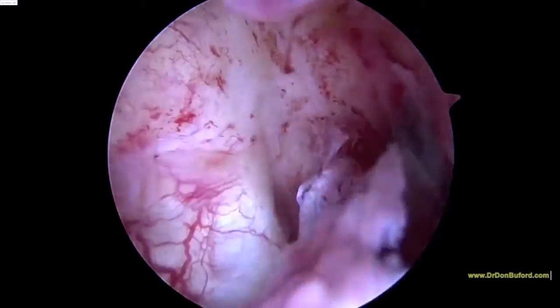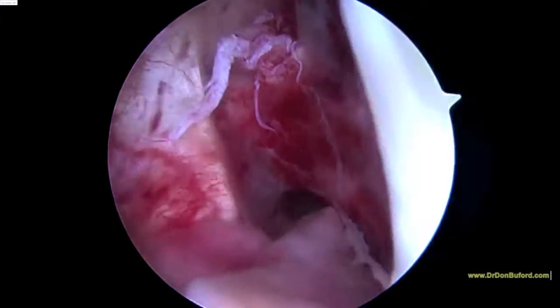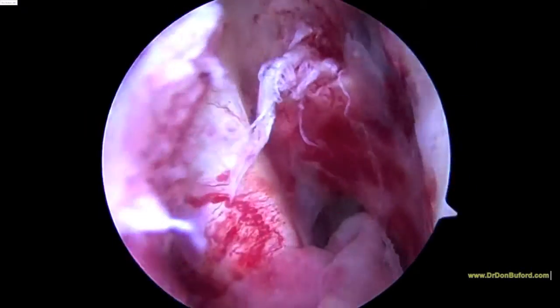As we look inside the notch on our initial arthroscopic view, we can confirm that. We see that this tear has some chronic changes.